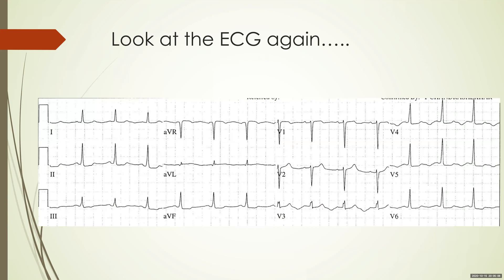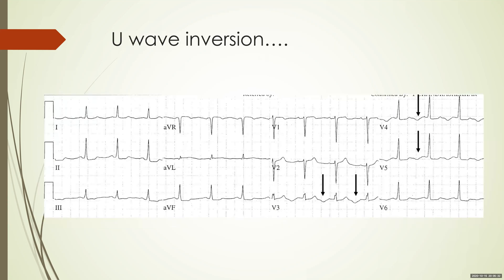Now let's go back to the initial ECG. Have a look at it once more and try to find out: is there anything in the ECG which suggests a sinister etiology? What have we missed? Can you name the waves of the electrocardiogram? On the next ECG, you can see marked U-wave inversions in V3, V4, and V5. The U-wave is normally a positive polarity wave, so these are clear-cut U-wave inversions.